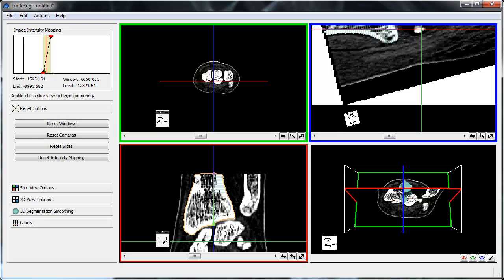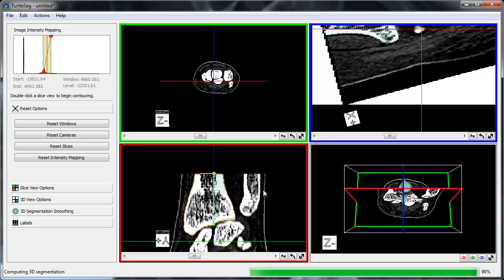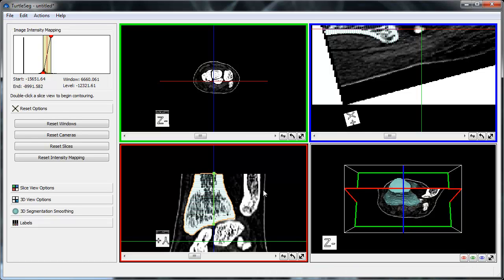Alternatively, we can choose not to worry about this now, and let TurtleSeg attempt to link them automatically when we rebuild our 3D segmentation, which I will do now through the keyboard shortcut Ctrl-B. As you can see, the other end of the purple line segment turned green indicating that it is now linked with the previous contour.